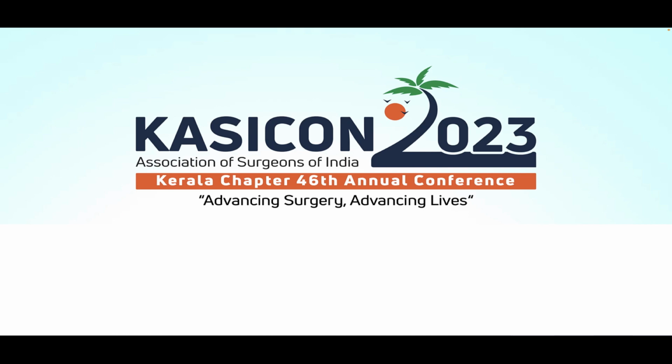It is told that any patient who has a major trauma, meaning the patient has sustained a significant road traffic accident, those patients, it is better to go for a whole body CT. Whole body CT means we have to start from the head and go till the upper thigh. That is specifically done in patients who have a major trauma, whereas E-FAST is recommended in all trauma patients. I hope that answers. Any question from the floor?